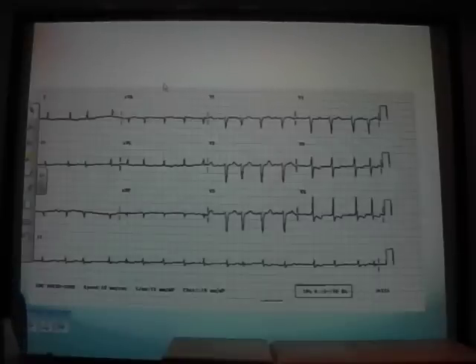Where's the T-wave inversion? Yeah. Brilliant. What do you think that might be? Posterior. Okay. They're not in pain. No, they're feeling a bit sick, but they're not in pain. Digoxin toxicity. Well done. These are reverse tick ST depression, and T-wave inversion. I thought it was demonstrated quite nicely here. You can see them here in V5 and in V6.